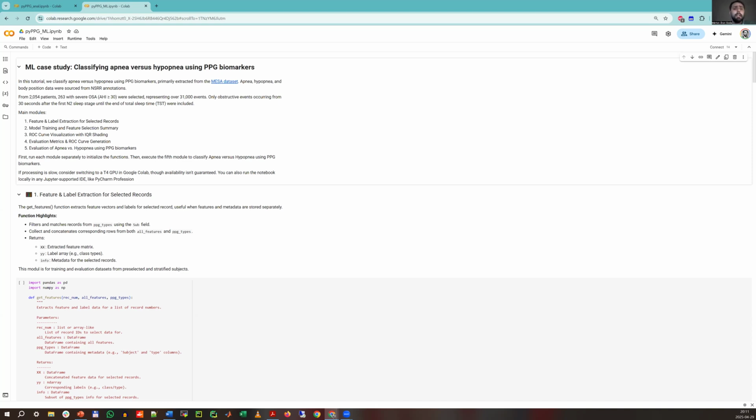In this study, we worked with the MESA dataset, and we tried to investigate the apnea and hypopnea events. And the annotation was obtained from the National Sleep Research Resources. So that is one of the connections of this web seminar as well.